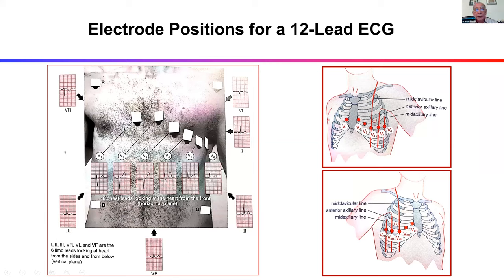So you can see over here, they have different morphology. See your PQRS complex here, and see over here, totally different. The morphology of the QRS complex will definitely differ in different leads, and they are unique for that position in a healthy heart.